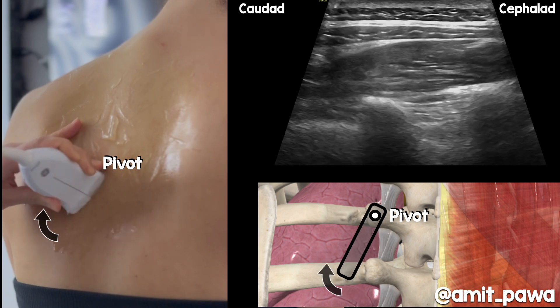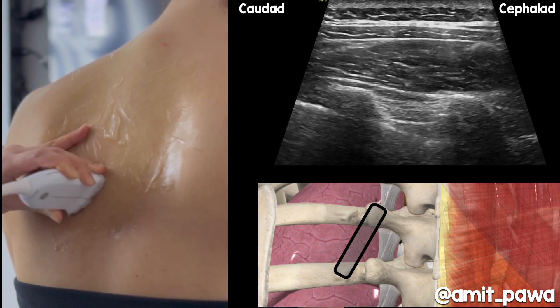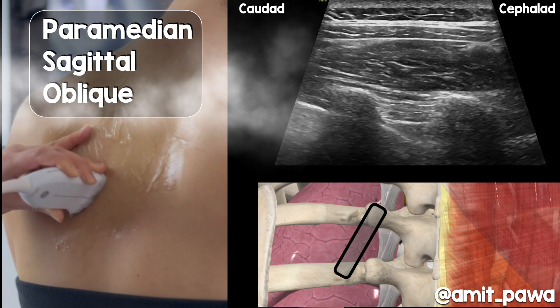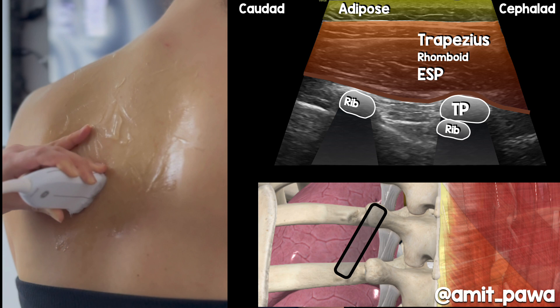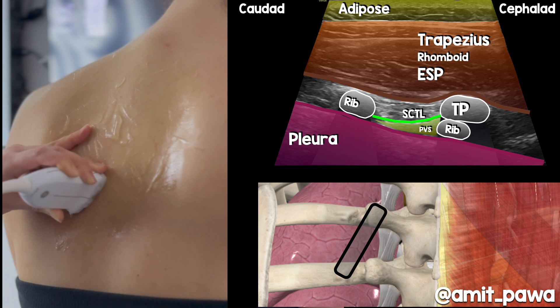We're going to pivot on the cephalad part of the probe and direct the caudal part laterally, so we're now scanning over a rib. By doing that, we've opened up the paravertebral space. You can see the superior costo-transverse ligament and the pleura, with lower caudal bony impedance so the needle comes in much easier. This is the paramedian sagittal oblique view. Here are the paraspinal muscles, and the cephalad bony shadow is formed by the transverse process overlying the rib. Because we've obliqued the caudal part of the probe, we're now scanning over the rib and have opened up access to the paravertebral space, with the pleura deep to it and that lovely superior costo-transverse ligament with a large paravertebral space deep to it.